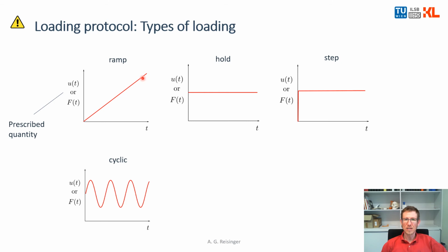That's a fatigue question. Yeah, so the usual load case of a hip implant is the patient is walking over years, making millions of steps. And what happens from time to time is that the implant is suffering from fatigue and then breaking at some point in time.